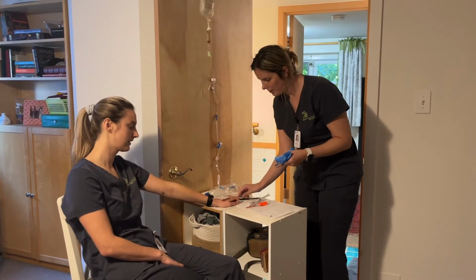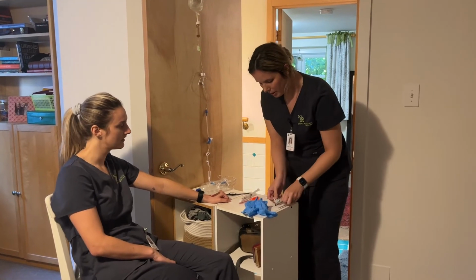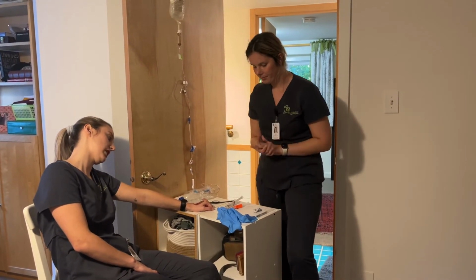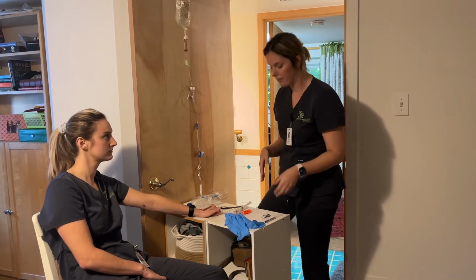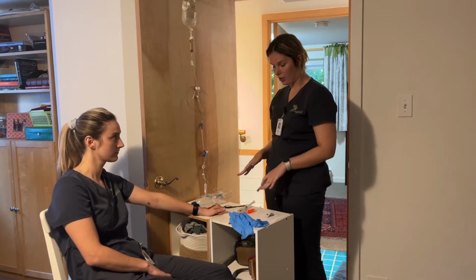Hi, Miss Whispers. Hi. How are you? Good. Can you just state your name and your date of birth for me? Soft Whispers, January 1st, 1968. Okay, so I have that furosemide drug I was talking to you about earlier. I'm just going to do my last medication check. Okay.